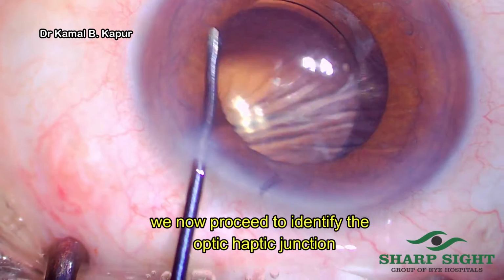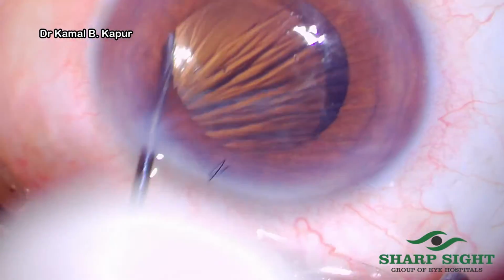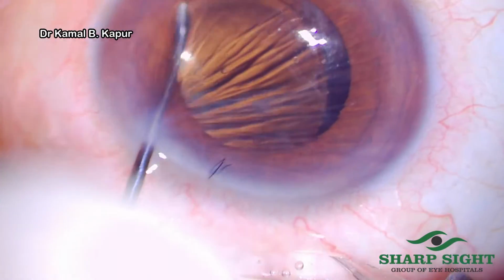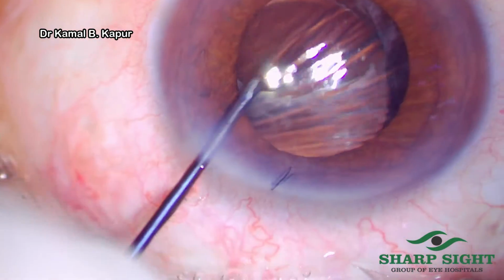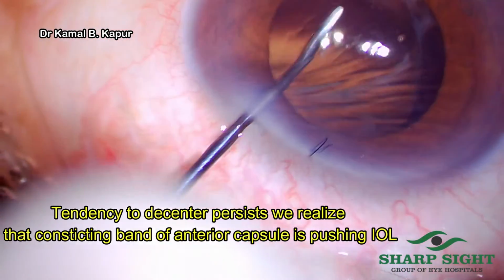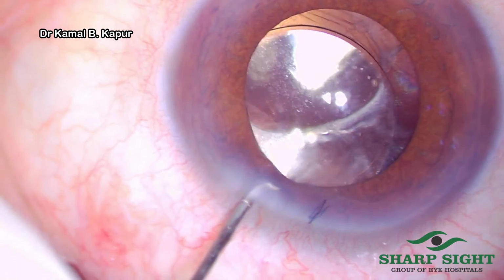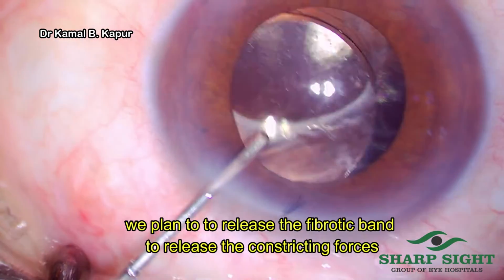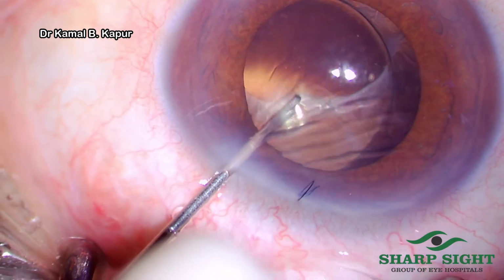Then we plan to identify the haptic optic junction of this lens so that we could know and estimate where is the opposite side haptic stuck up inside the capsular fibrosis. We negotiate and move the IOL in a slight dialing movement to free up the other hidden haptic. Once that is not achieved, we realize that there is a fibrotic band on the capsular rhexis edge which is actually constricting this capsular rhexis and also pushing the haptic along to the other direction.